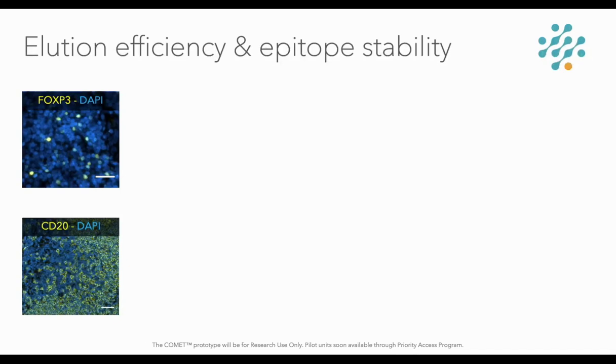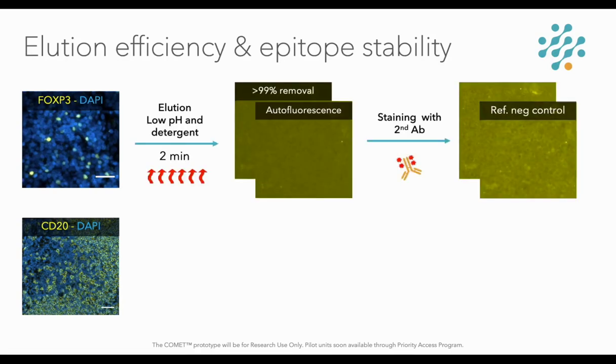Before a multiplexing assay can be performed, we need to go through a series of optimization steps. Our technology allows for playing with multiple parameters such as temperature, incubation time, the use of dynamic incubations to achieve more homogeneous stainings, performing multiple flushes, etc. To achieve a good multiplexing experiment, we make sure that we can remove the signal of every staining in order to avoid non-specific signal appearing downstream in the protocol.